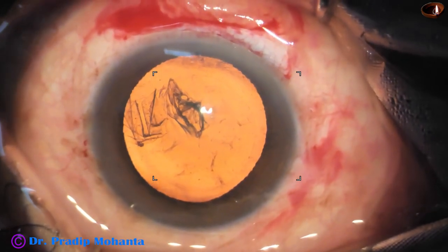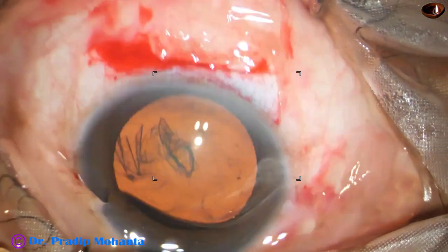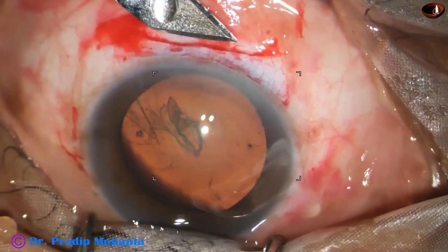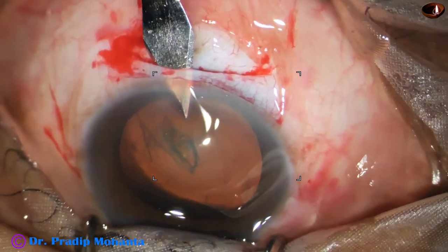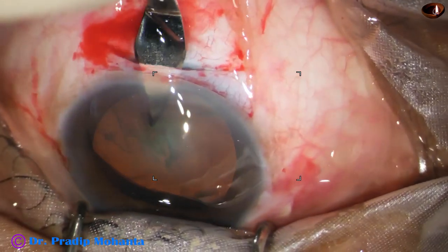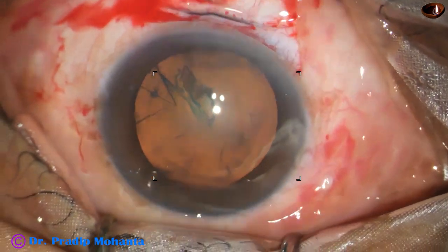This is a 26-gauge bent needle and now we are going to open the tunnel. A keratome is taken — this is a 2.8 millimeter keratome. Go to the anterior extreme of the wound, enter into the anterior chamber, and cut the tissue only during forward movement, so that we get a very nice corneal valve and the wound becomes self-sealed.